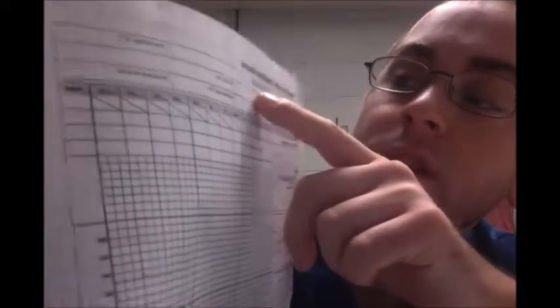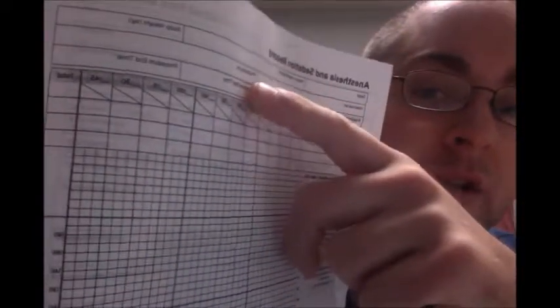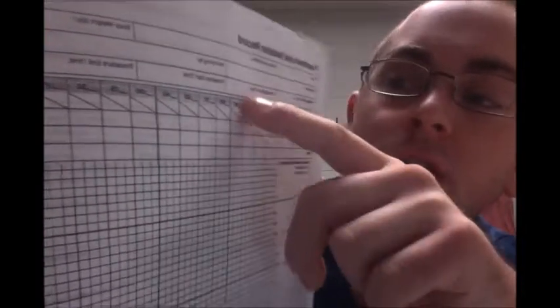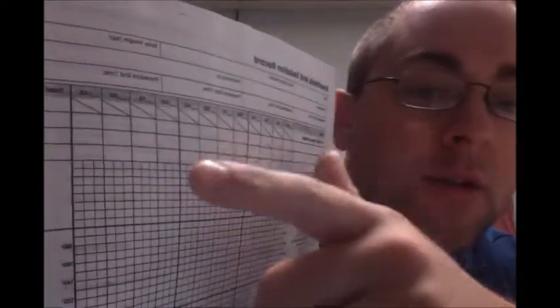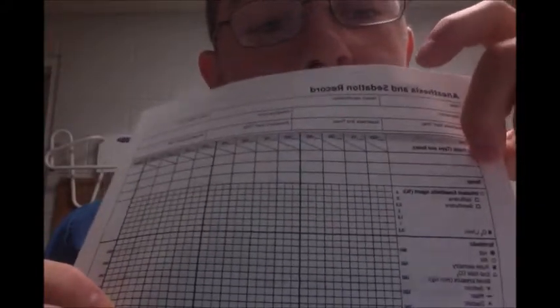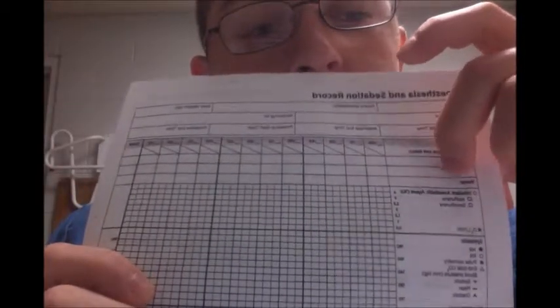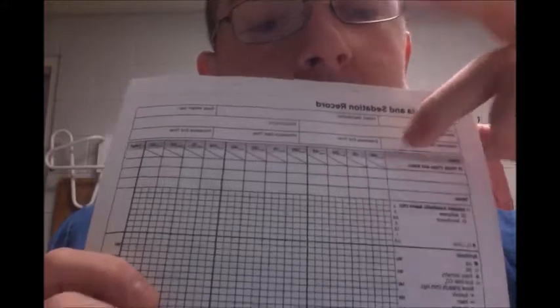And then on the back is actually what we use for monitoring. So we've got date, patient identification, the weight, the veterinarian who's monitoring, all that good stuff. Procedure start time, procedure end time, anesthesia end time, anesthesia start time. So up here we have the IV fluids and rate, which is on the other side, but we like to have it on here too. So we like to put that down here, and then we just mark a plus if they are actually doing it.